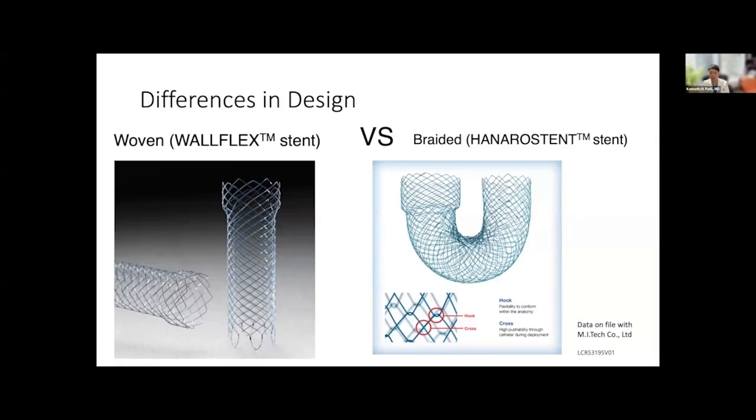The reason why these things are important is that there are not only different stents with different names and different companies, but there are actually innate differences in the stent design underlying those fancy marketing names. I think this will help you understand why in certain situations one type of stent or one company's stent might be better than another. And I think understanding is very important.